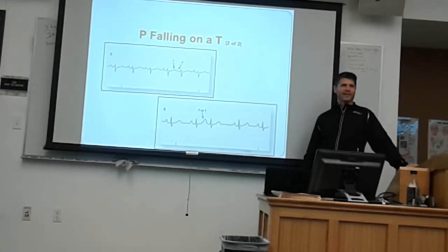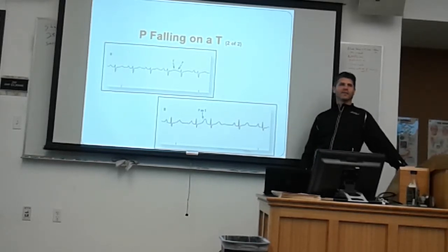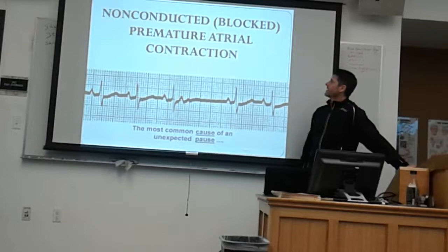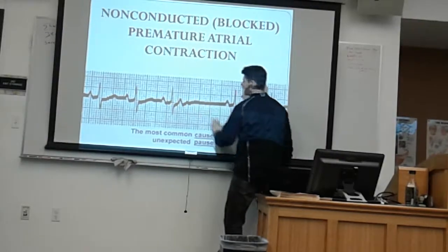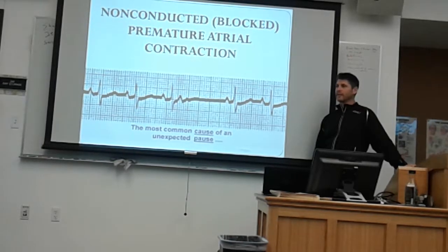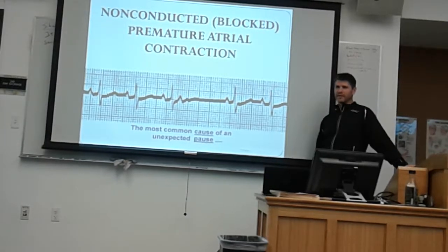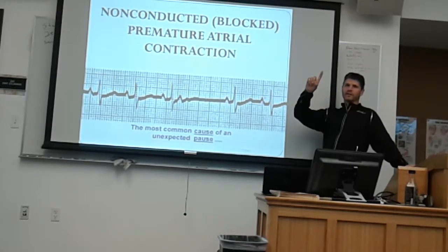Right? You're not, right? But I would imagine that a few of you have had a PAC since sitting in this room, depending on what you're drinking or eating or whatever the case is. So remember, if we have a blank spot sitting here for some reason, I don't jump to assuming a block. Jump to assume a PAC and rule that out. Then if you don't find evidence for a PAC, you can start thinking about some sort of a block or a pause. Does that make sense?